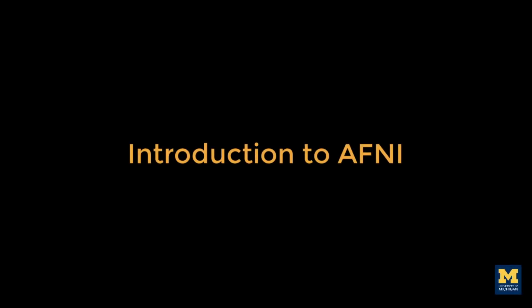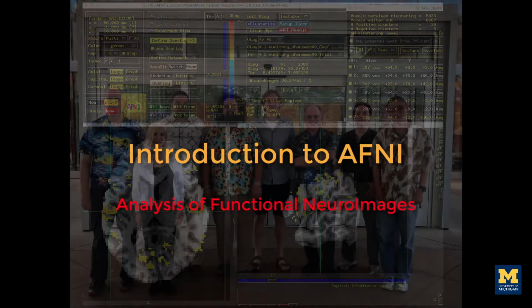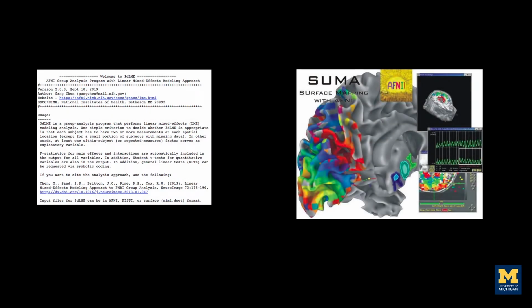Welcome to a new fMRI tutorial series on AFNI, the Analysis of Functional Neuroimages package. First created by Bob Cox back in the mid-1990s, AFNI has been maintained and developed by a team of scientists at the National Institutes of Health beginning in 2001. Since then, they've added several new features such as linear mixed effects models and surface-based analysis.